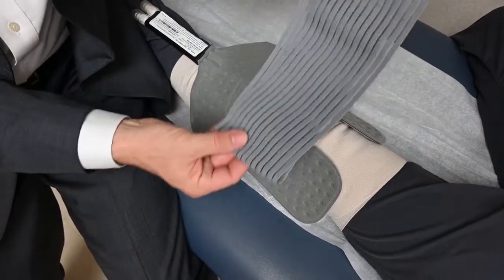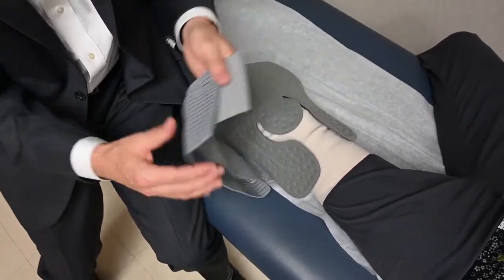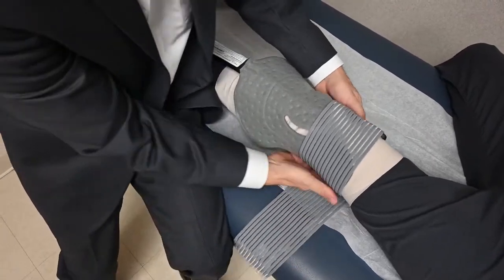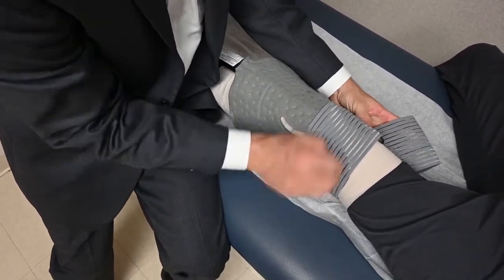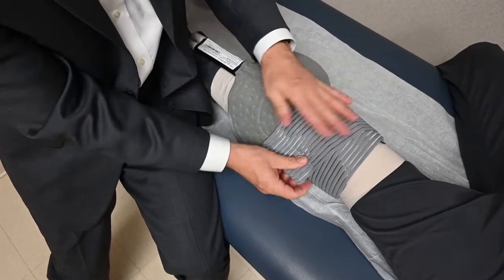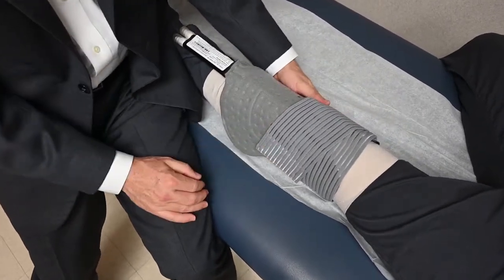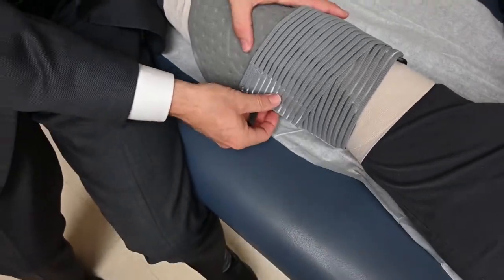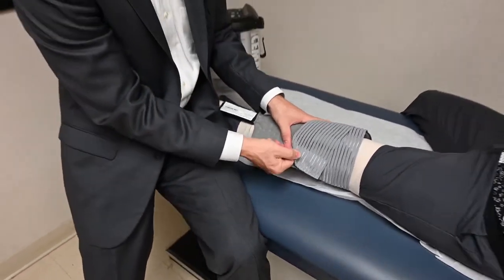The polar care comes with a series of straps with velcro that you can use to wrap the polar care around the knee and hold it there while you are icing your knee. When you are done, you simply remove the straps and go back into your brace.